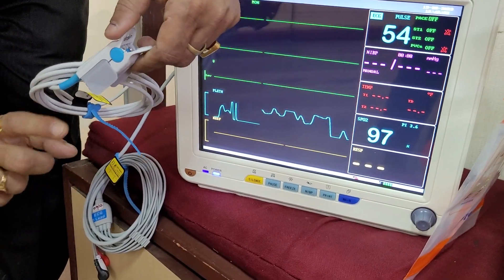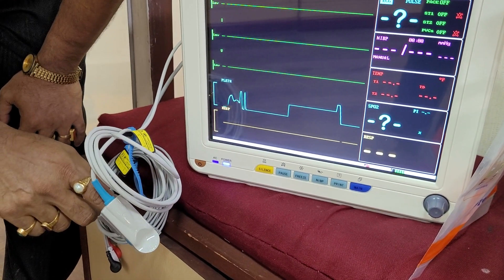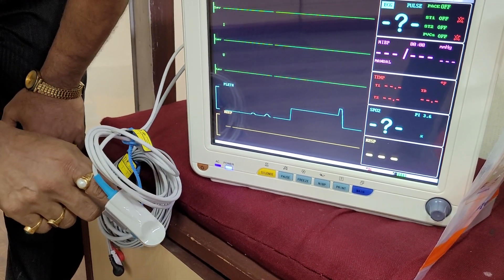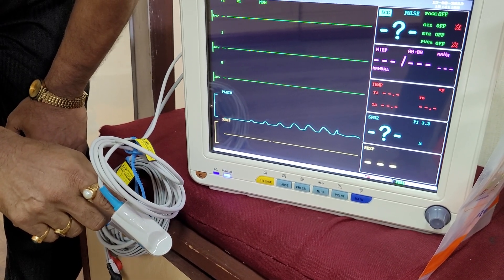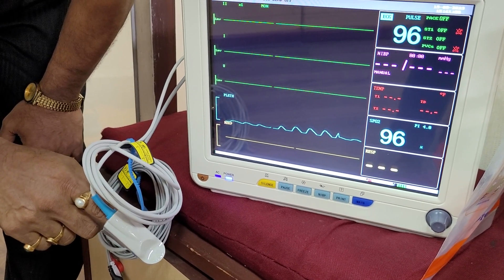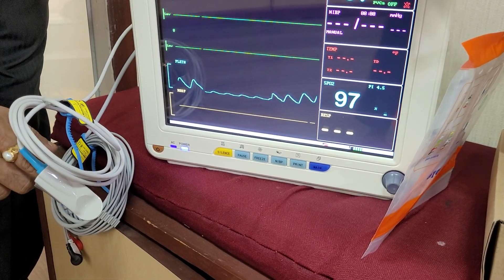Again I can show you — 97, 97 is the SpO2 reading also there. Again everything is shown.